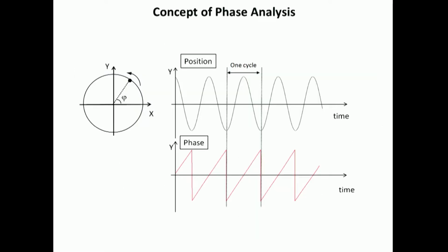And I would like to explain a little bit what phase mapping actually does. Instead of looking at a function as the result of time, you can also look at the angle of the point of this function if you project it on a circle. So each of those data points is projected on this circular curve, and then you look at the angle between this point and the center as compared to a certain baseline. And this angle will, of course, increase to 360 degrees, and then at a certain reference line, there will be a phase transition. And for strictly periodic phenomena, this absolutely makes sense.